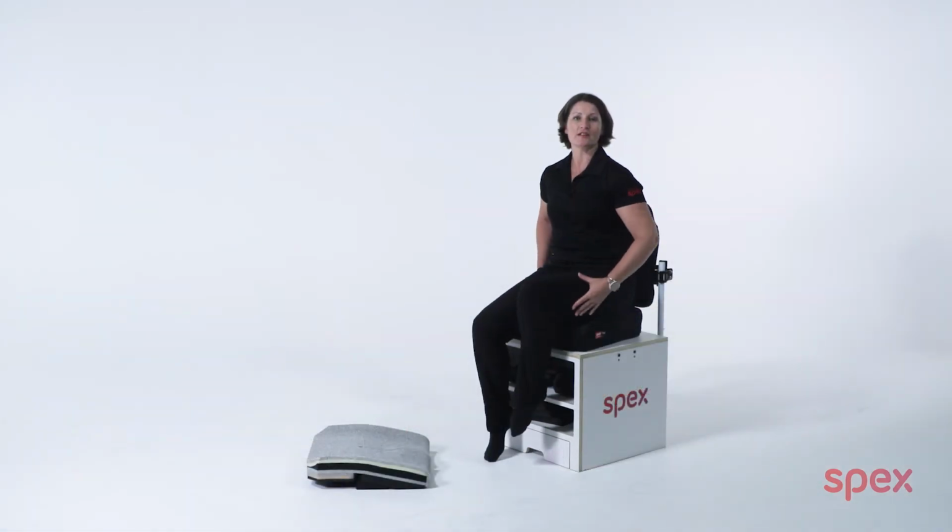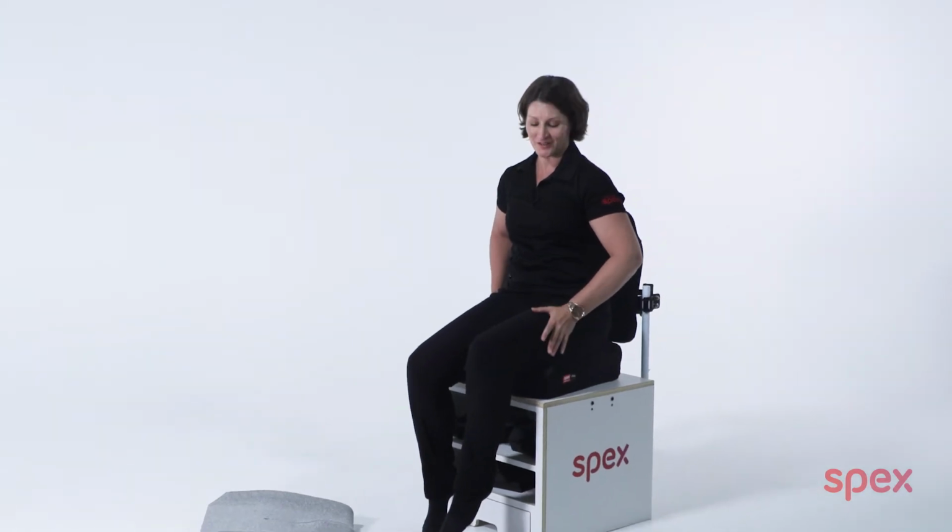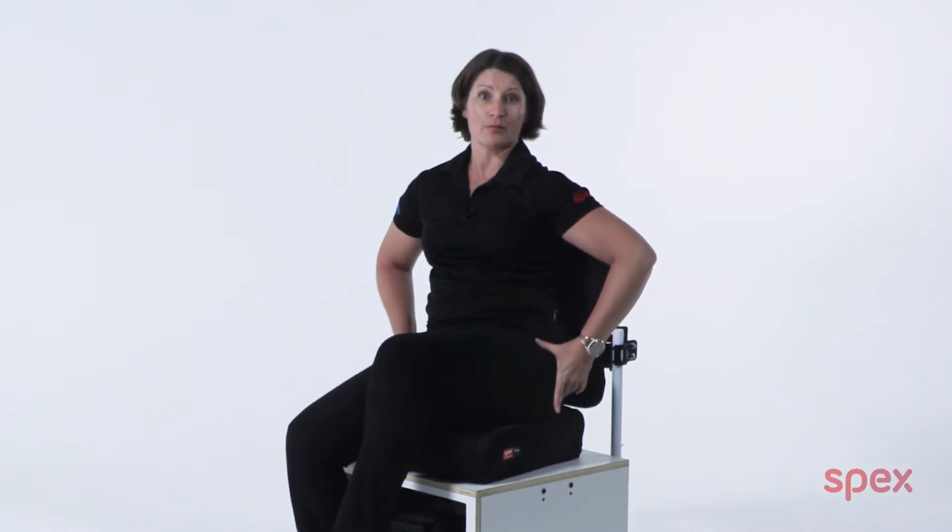Forcing the hip to bend on a standard wheelchair surface creates secondary postural deformities, as I'm now going to try and demonstrate. The wheelchair user may present with discomfort, they may present with pelvic rotation, they may present with a hip obliquity and potential pain if they're unable to raise their knee sufficiently and we're forcing them to do that.